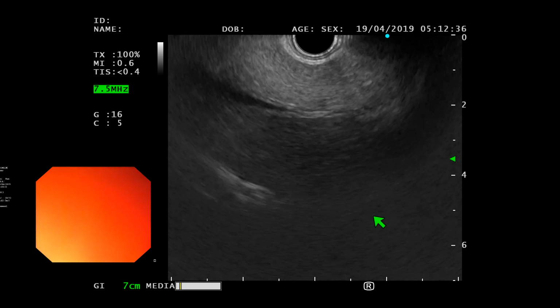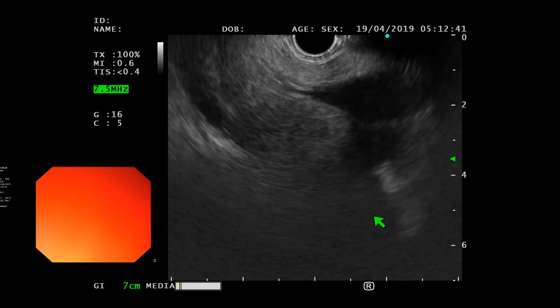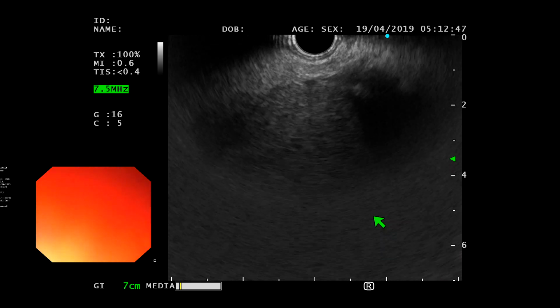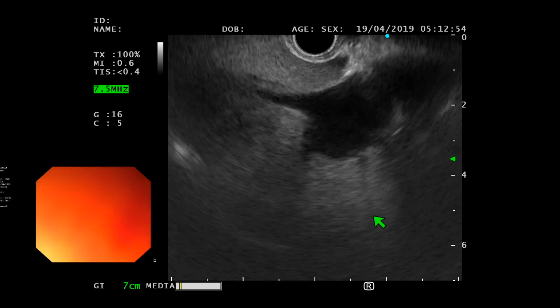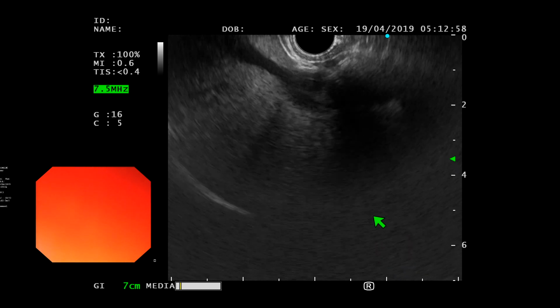When I know that he knows the step and is not able to do it, then we go through the maneuvers that will take him from point A to point B. And even if that is not happening, then at that point we'll take the scope, we'll show them how to do it, we give the scope back, and if this isn't working for them the second time, at that point I'll take the scope and we'll move to the next step.